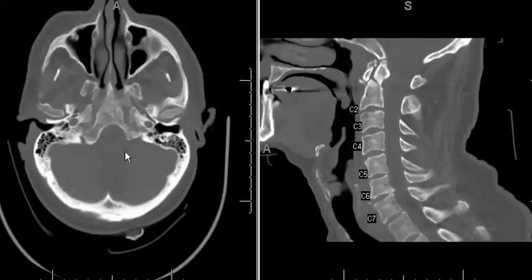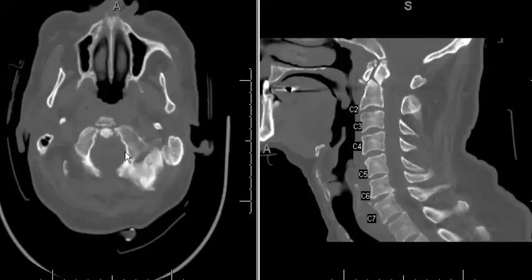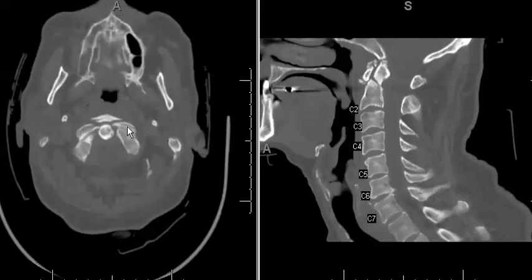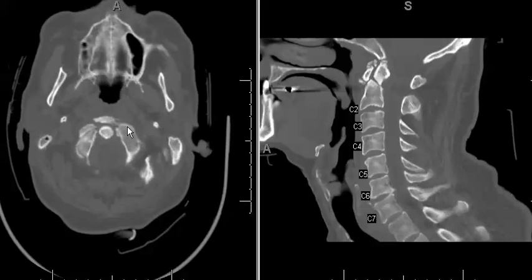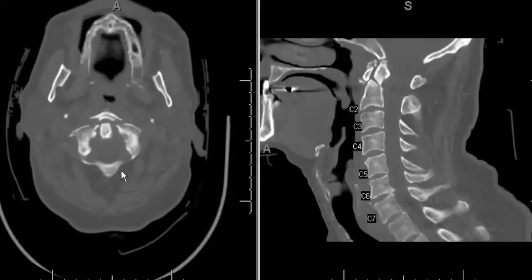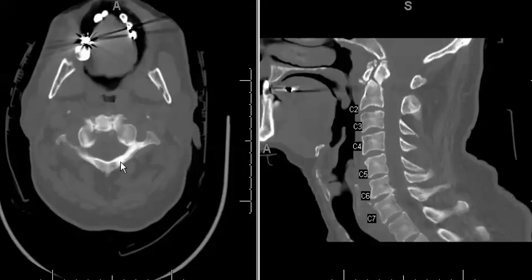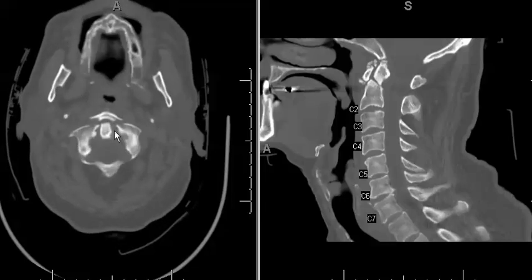We also have a two-part Jefferson Burst Fracture. A Jefferson Burst Fracture can involve two parts, three parts, or four parts. In this case the posterior arch was preserved — there was no fracture there — but there was a two-part fracture along the anterior arch, representing a two-part Jefferson Burst Fracture. This fracture is usually a result of an axial load injury.